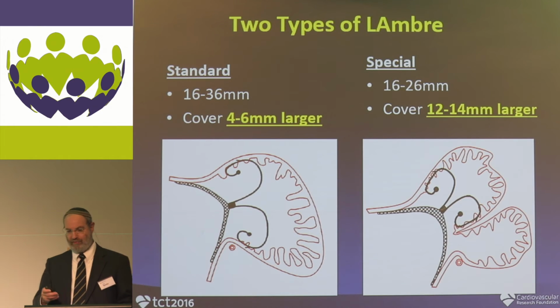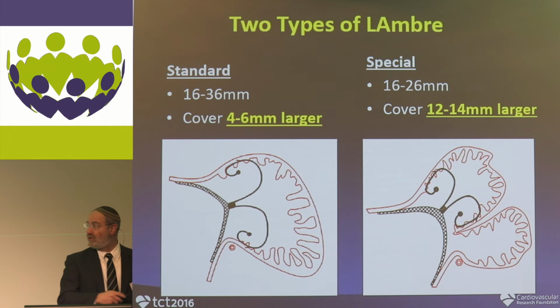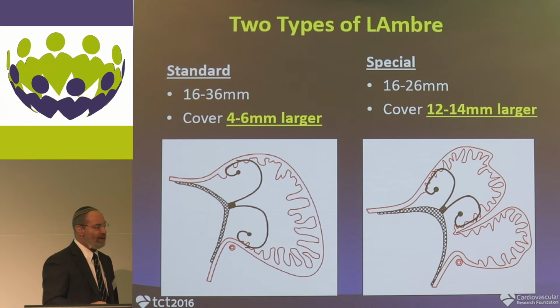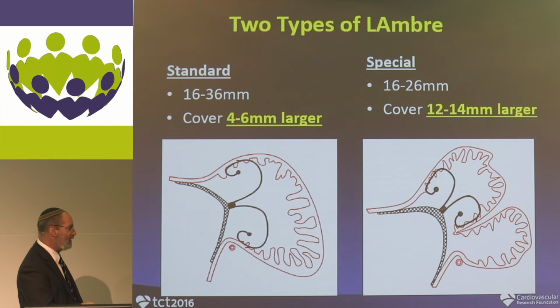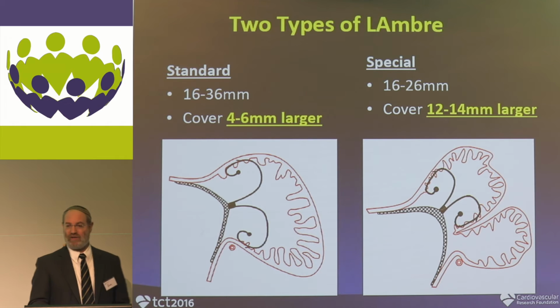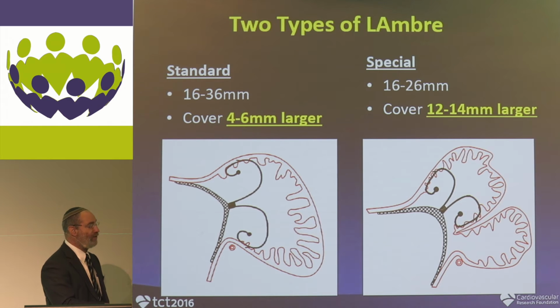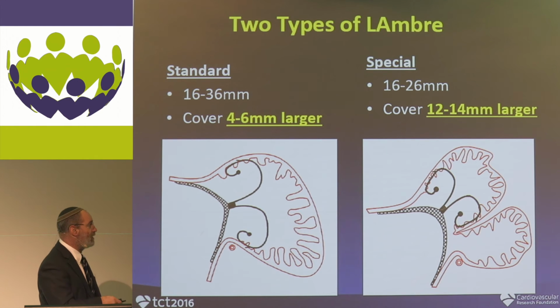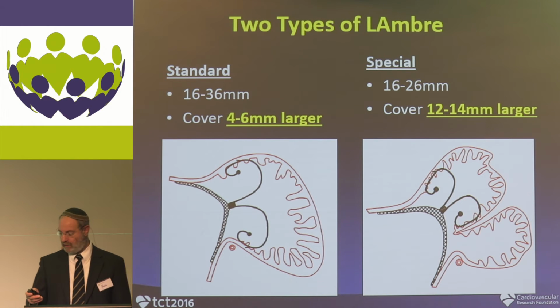So the interesting thing, I think the newer thing that's come along, is that there was the standard device, and I'm sorry I'm only pointing on this screen here, the standard device which has got a retainer and a disc, but the nice idea they came up with is what do we do with a bi-lobed appendage? So they placed a small retainer with a large disc. So you can therefore deploy it in one side and not have to commit to a large device in the entire area. So that's an interesting development, and as you can see, the disc is 12 to 14 millimeters larger than the retaining anchor.